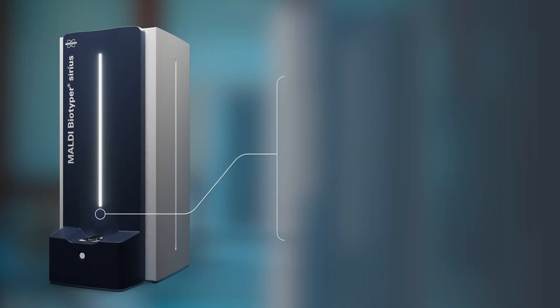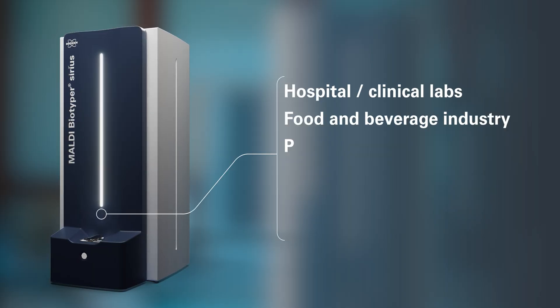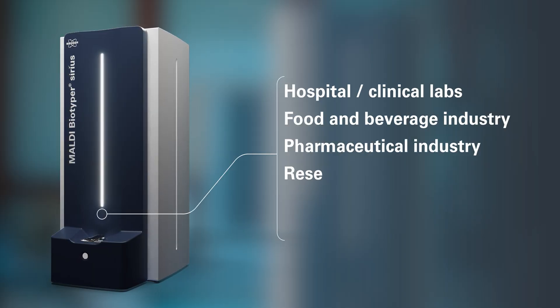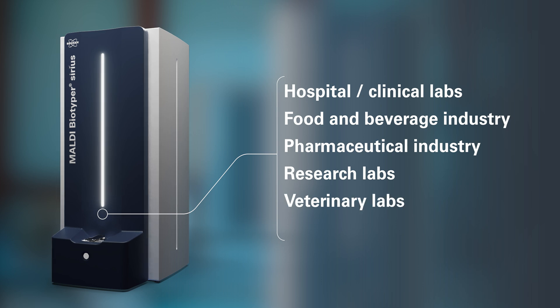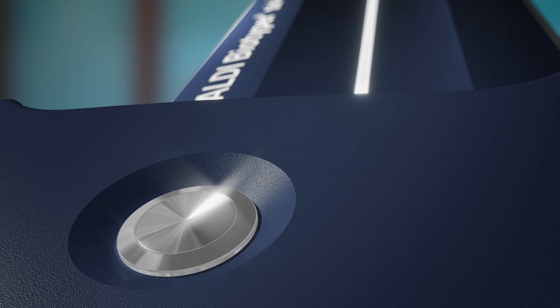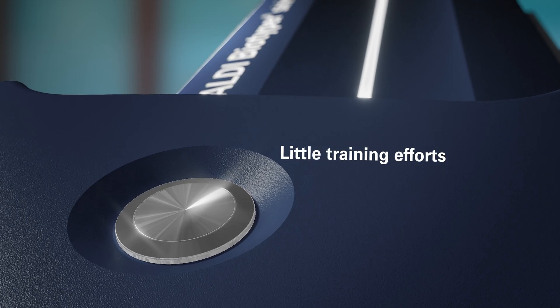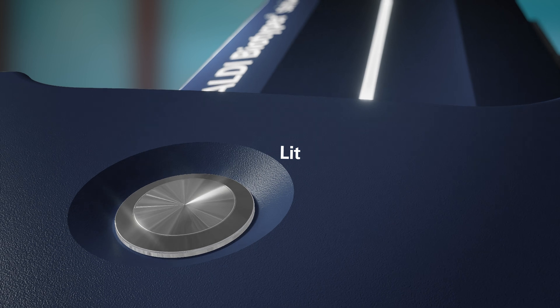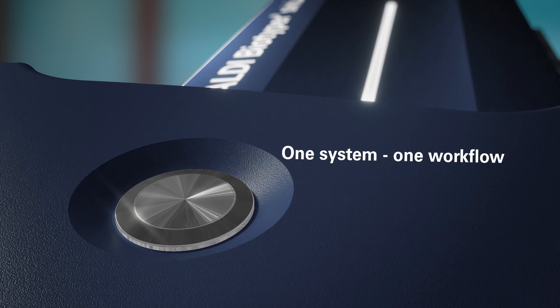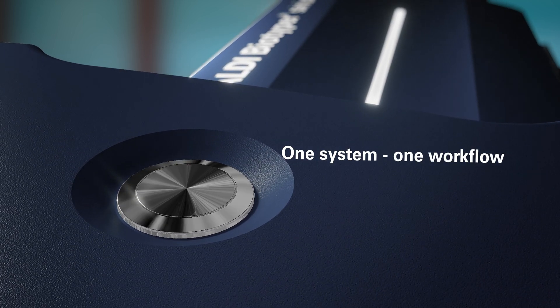The MALDI Biotyper comes in various flavors, making it suitable for any type of microbiology lab. Little training effort is required. All you need is one system, one workflow.